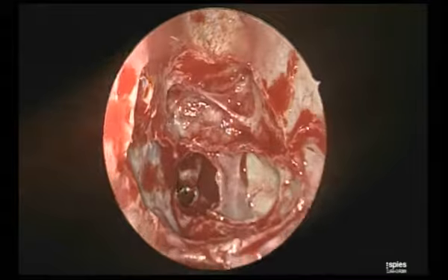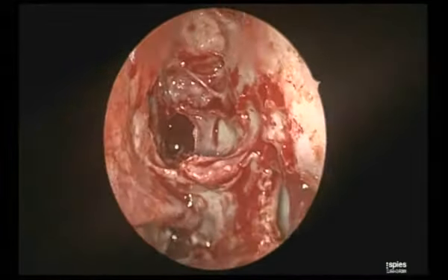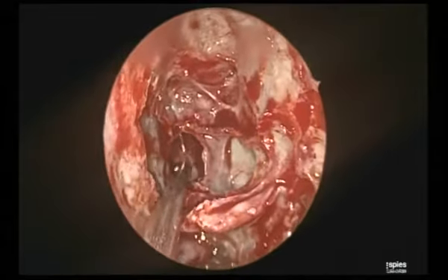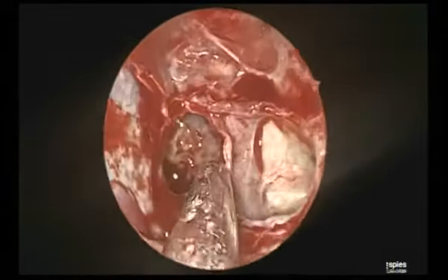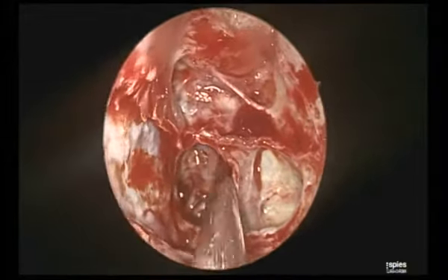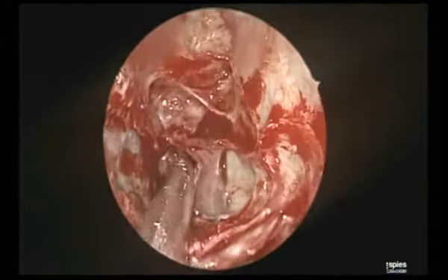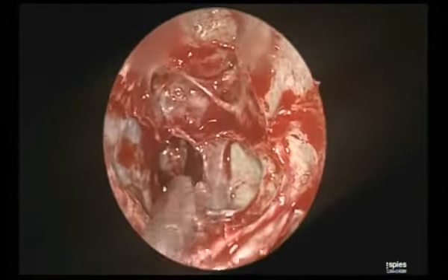So this is the landmark I wanted. I told you, post-ethmoidectomy is the only step which can kill the patient. And this is the intelligent guy, Mosher, if you have heard of him. The simplest way to kill a patient is to do an ethmoidectomy. He knew this at the beginning of this century, the importance of post-ethmoidal surgery.